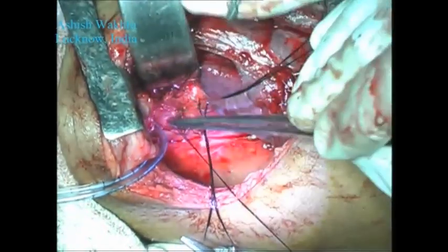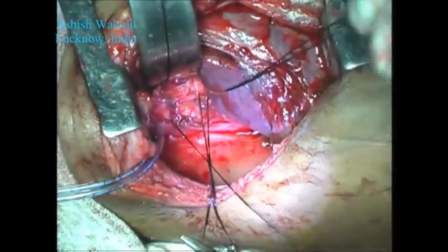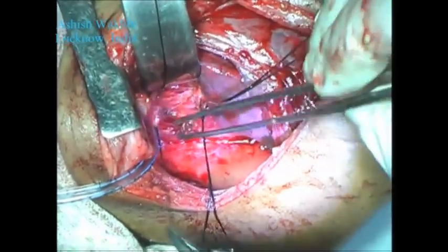So there you can see the stump of the right main bronchus being held up between the two individual stay sutures, and this will now be opened for the anastomosis.